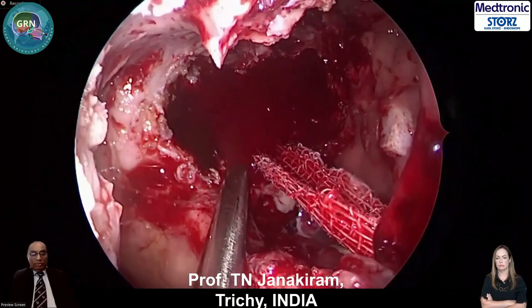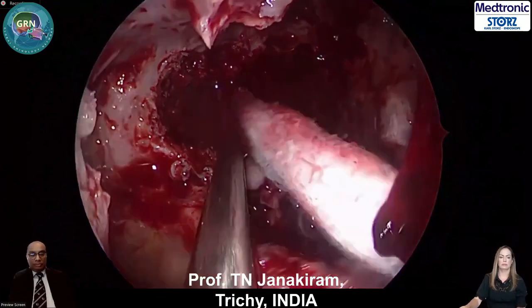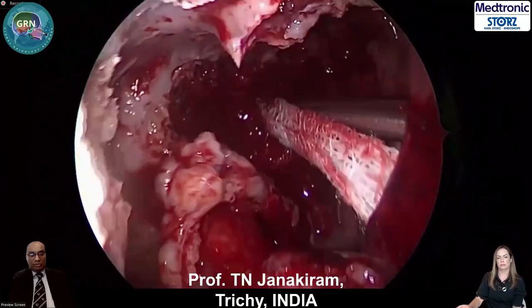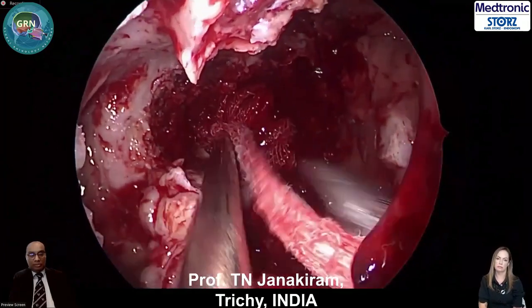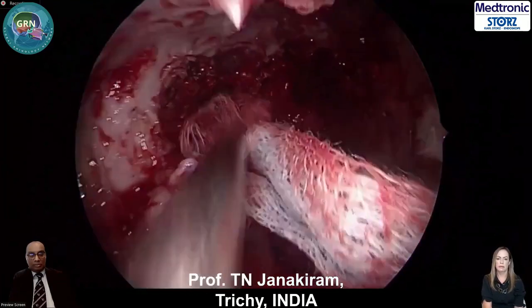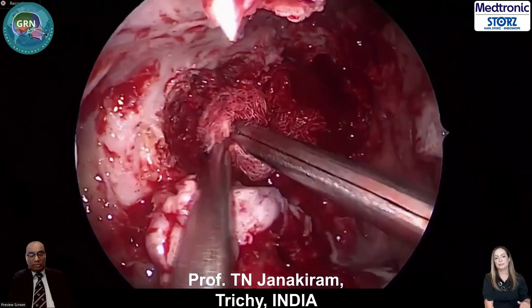So almost done, but the most important part, I want to show you that this is the one which has come out. The big one is the bulk of the tumor, but this will lead to recurrence if you leave it like that. So what I have to do is to remove all those small daughter, granddaughter, everything out.